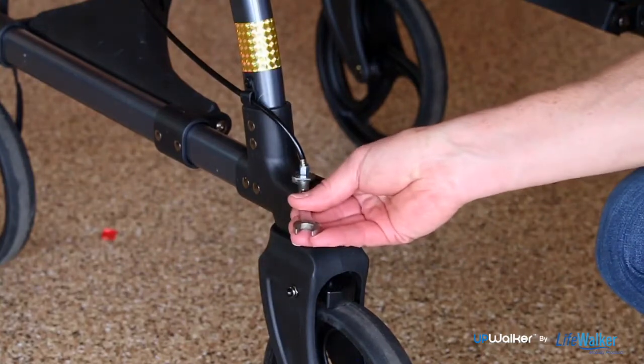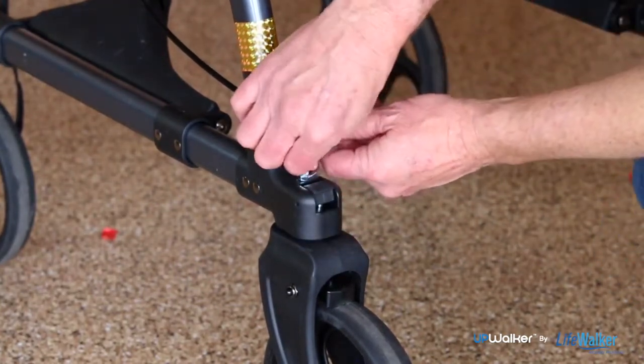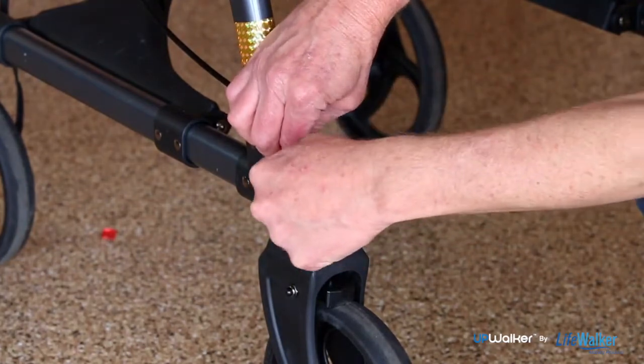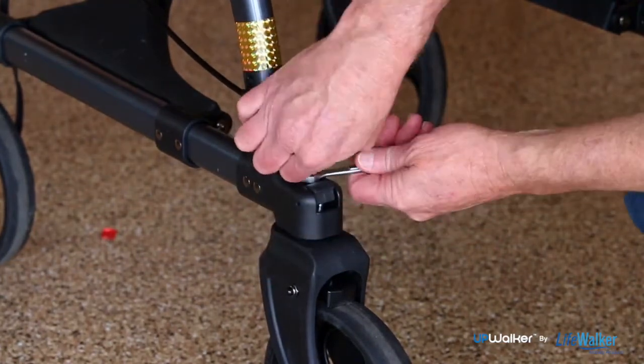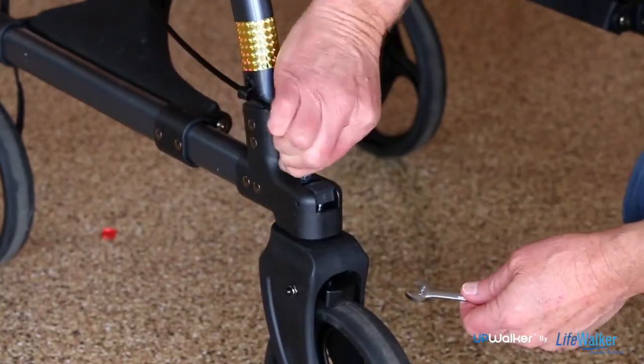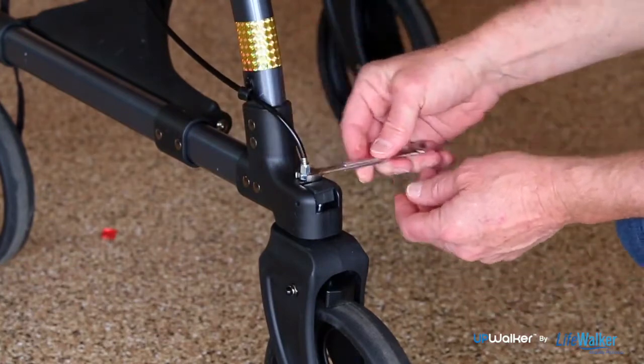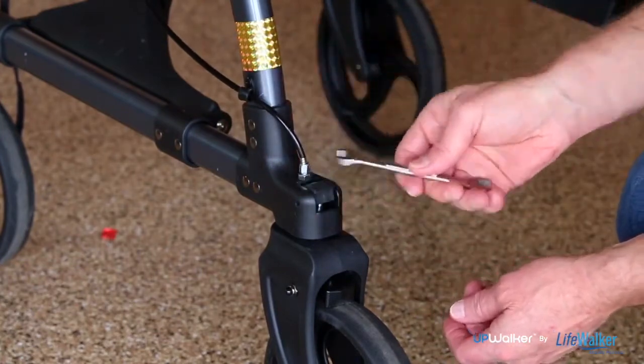The brakes on your new UPWalker have been preset from the factory. Due to normal use, over time you may need to make adjustments to maintain this setting. You can adjust the brakes by making the following adjustments at either brake handle position. In addition, you may adjust the brakes at each of the rear wheels.